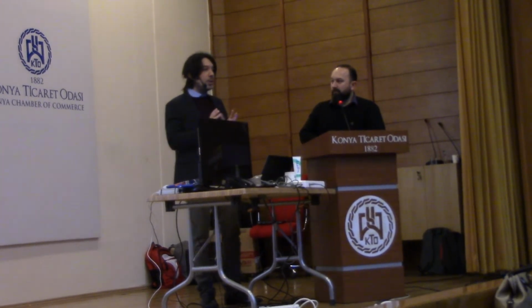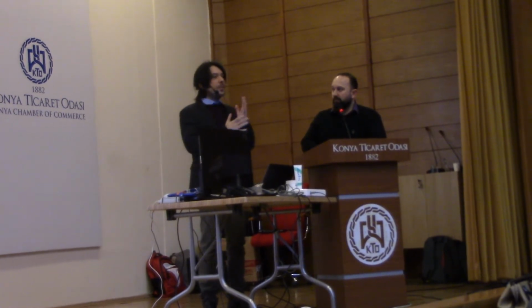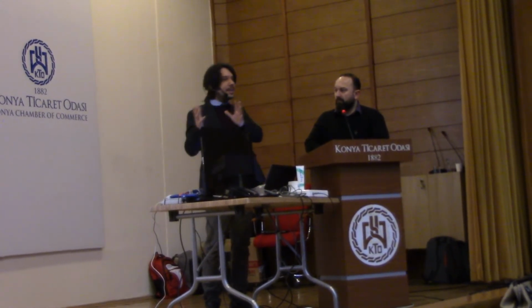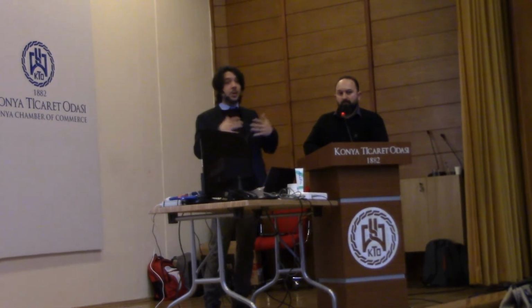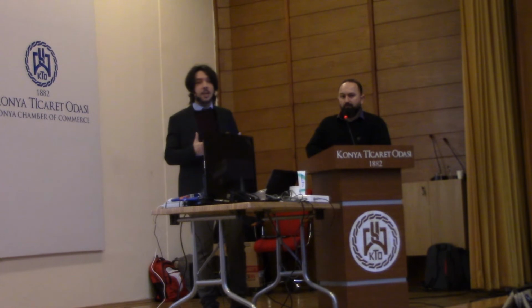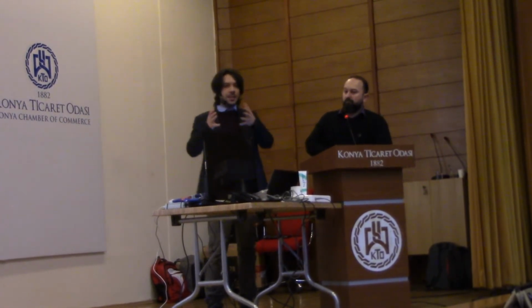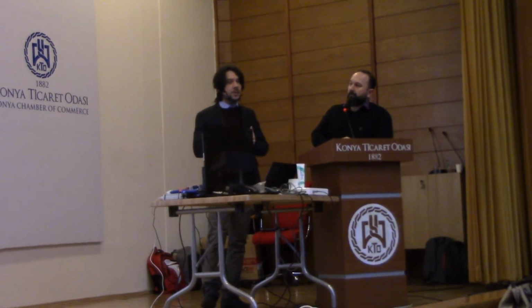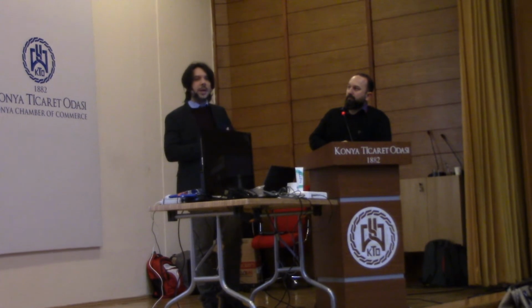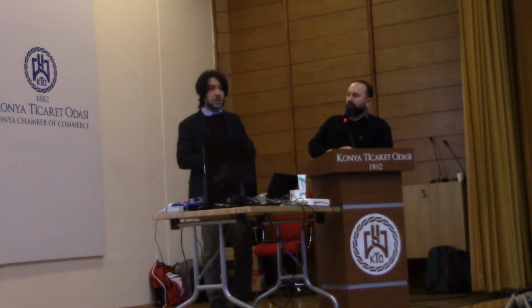According to the pathology, the latencies can display differently, and the pathology can be complex. So sometimes it's hard to understand if there's a response or not. But there are some tips, some technical ways, some consciousness on doing the test that can help you a lot.